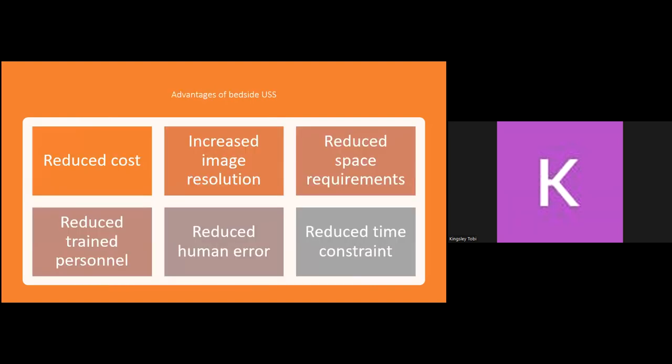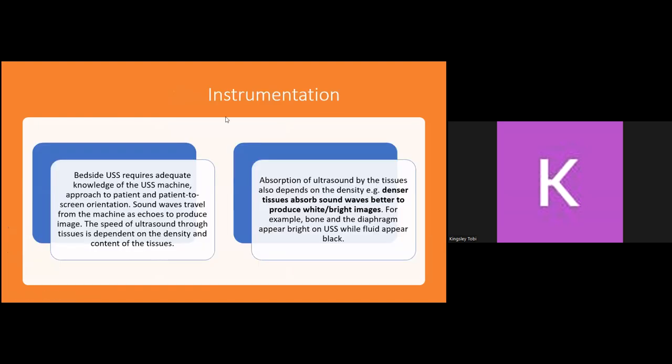All right, in brief, we'll look at the advantages of bedside ultrasound. It leads to reduced cost of care, increased image resolution, reduced space requirements, reduced need for trained personnel, and has helped to reduce human error. All of this, especially when time is of the essence, has reduced time constraints in the care of the critically ill in the ICU.